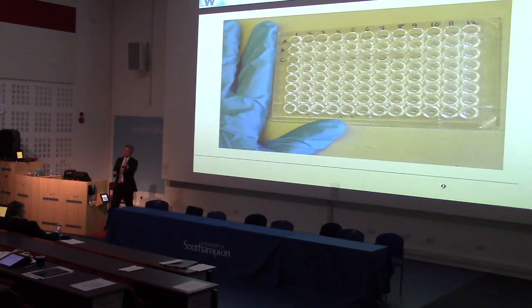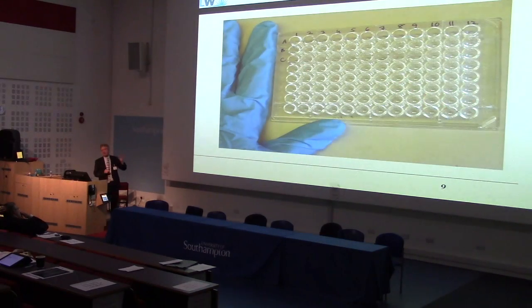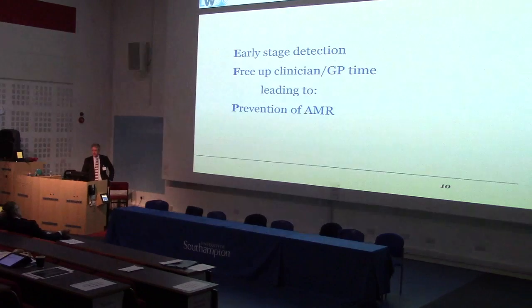Physically transporting this from A to B is quite hard. The patients can't really do it themselves. This involves putting this in a cup of urine, which you can do, or other fluids, and so people can do that, whereas that is really an in-lab based device. And you may have biochemicals inside already, preconditioned. So this really resides inside a lab, the other one resides inside a home.